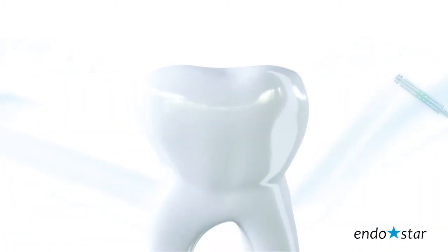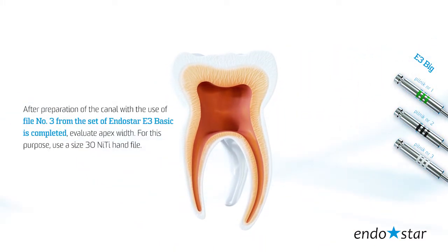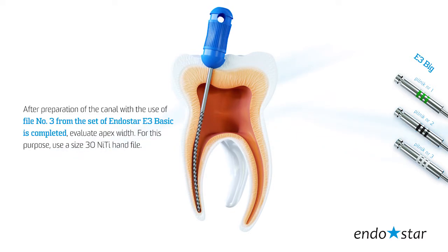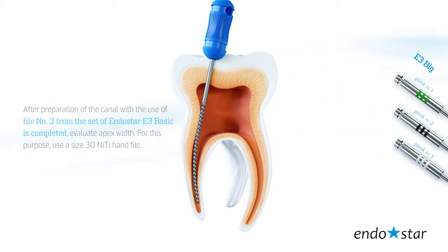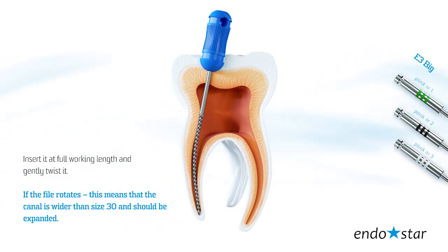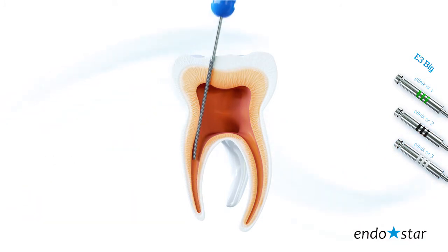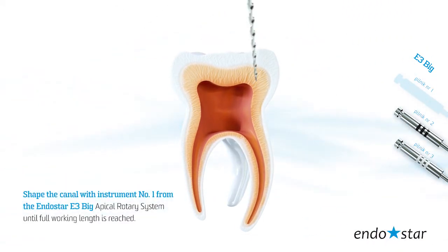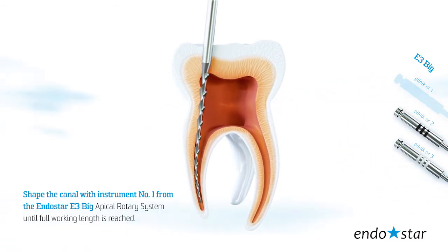Step by step: After preparation of the canal with file number 3 from the EndoStar E3 Basic set is completed, evaluate apex width. For this purpose, use a size 30 nickel-titanium hand file. Insert it at full working length and gently twist it. If the file rotates, this means the canal is wider than size 30 and should be expanded. Shape the canal with instrument number 1 from the EndoStar E3 Big Apical Rotary System until full working length is reached.